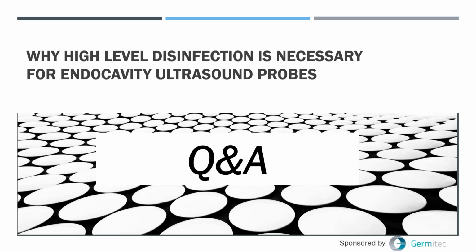Again, it's just the professional groups making recommendations, just wanting to have multiple layers of safety so that if in the chance one of your technologists, technicians, or nurses did not adequately clean the object, and therefore now you're only using the high-level disinfection, the probe cover is giving you added protection.